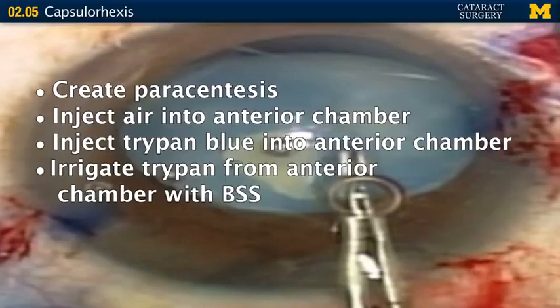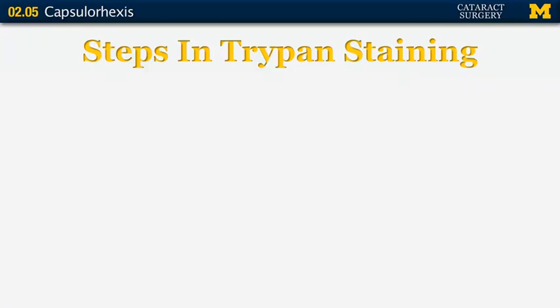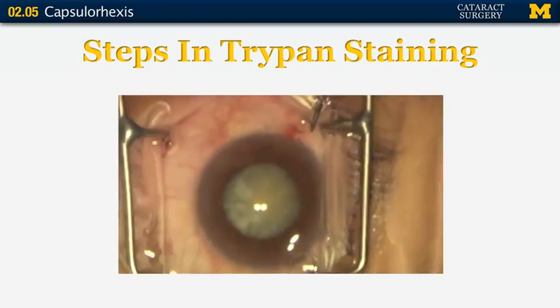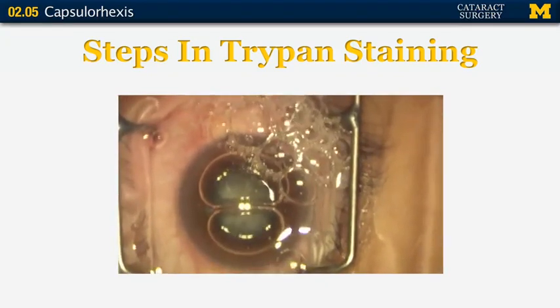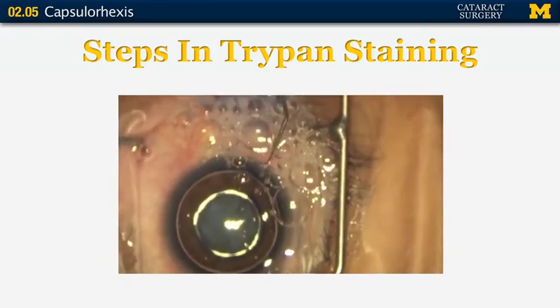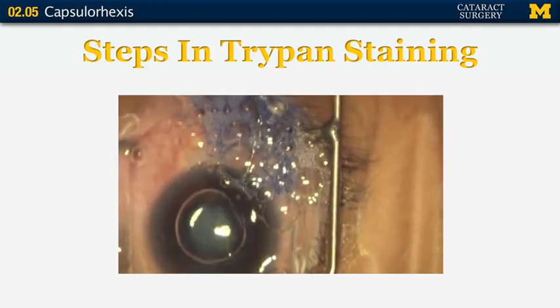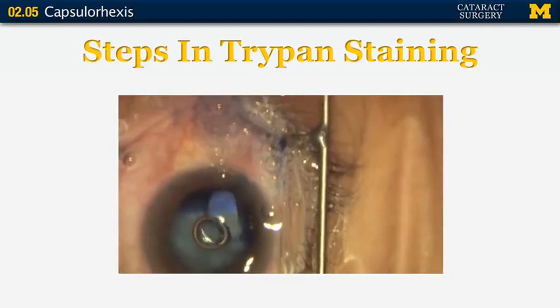Now we'll watch a video of the special stain being used, reviewing the steps. We make our paracentesis with a small angled blade, put air into the anterior chamber, then take our trypan blue stain and drop it right over the surface of the capsule. Once the capsule is nicely coated, take BSS on an irrigating cannula and irrigate that dye from the anterior chamber — it's amazing how much dye can get in there. Irrigate until you see the iris and lens very well and get the air bubble out.